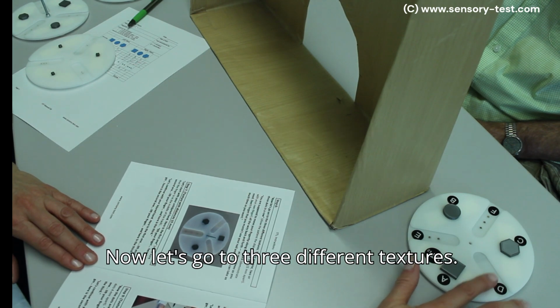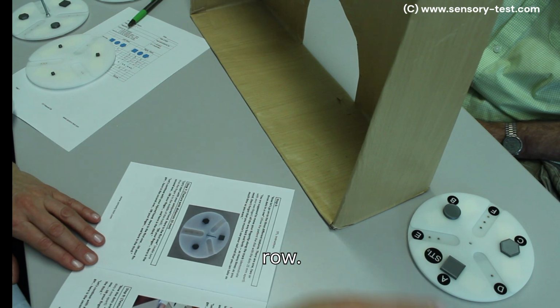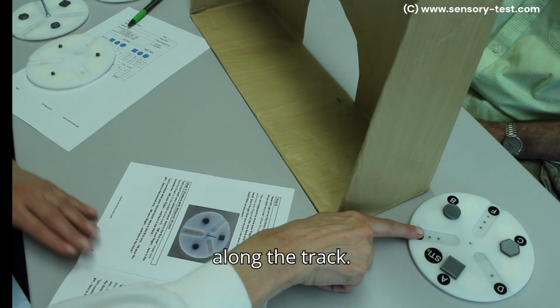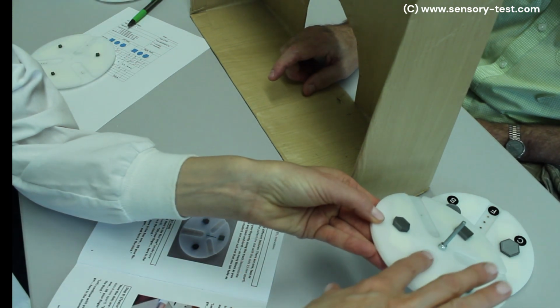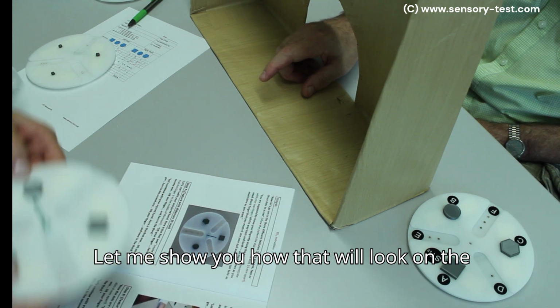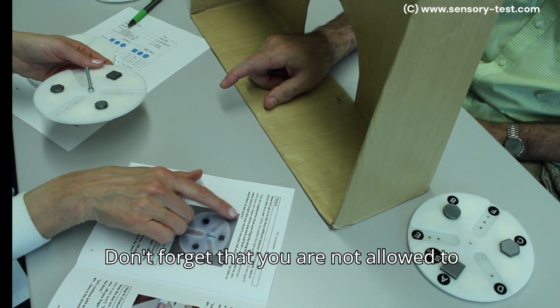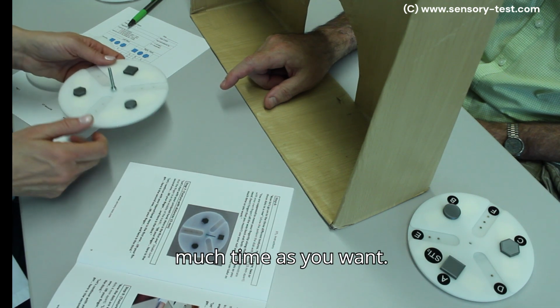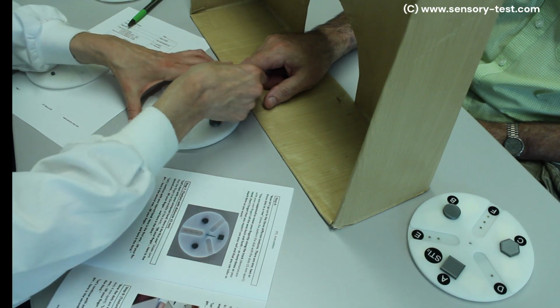Now let's go to 3 different textures. There are 1, 2, or 3 dots in a row. You are supposed to move your fingertip along the track. Let me show you how that will look on the disc. Don't forget that you are not allowed to use your nail, and that you can take as much time as you want. Let's start with your uninjured hand.